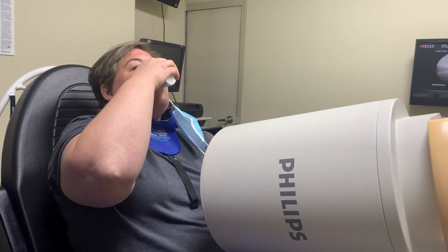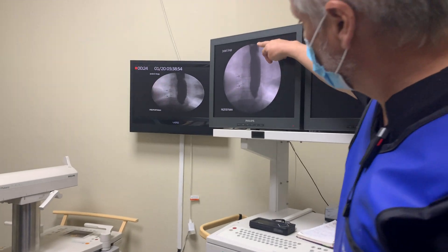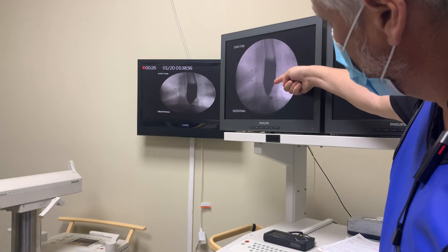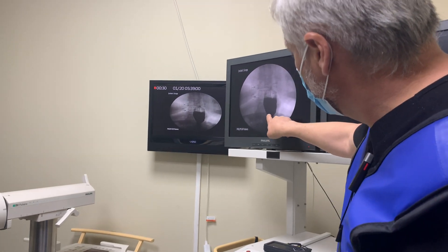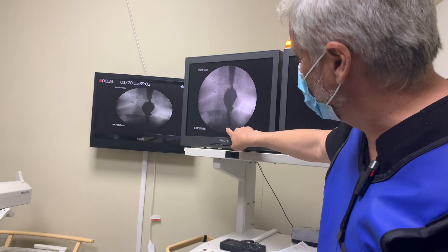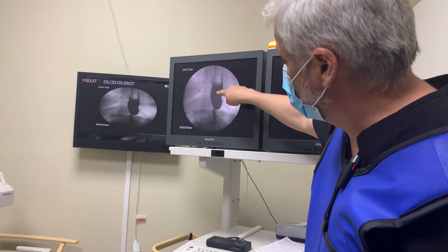You're almost holding your breath. Let's watch the screen. As we're watching the screen, we're seeing the esophagus as it's going down. The diaphragm is right here, and then immediately after the diaphragm starts the stomach. The liquid kind of holds a little bit there.